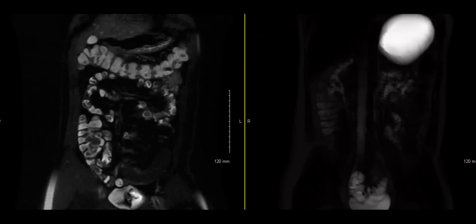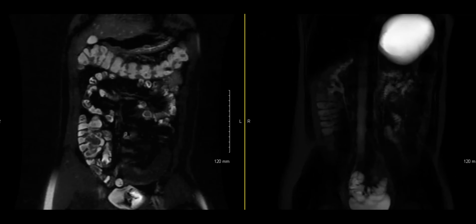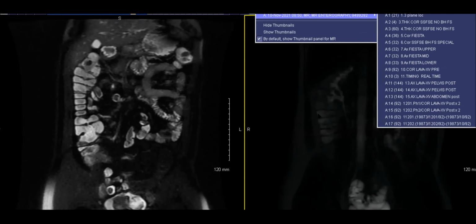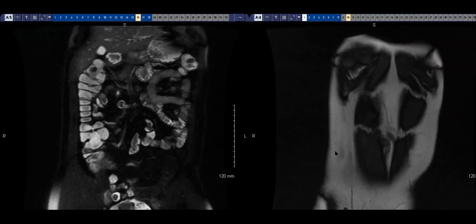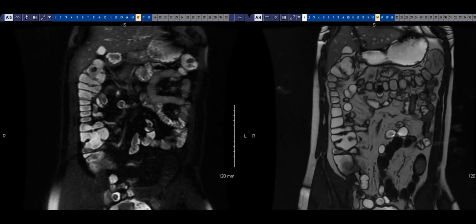Yes. So this is a young patient that came in, history was unclear, no really prior history, some sort of abdominal pain, blood, inflammatory bowel disease. So the fellow calls me and says, well, have you ever seen appendicitis on a random MRE? To be honest, no, I've seen appendicitis on MRI, but not appendicitis incidentally found on MR enterography. So the resident is all proud and says, well, look, clearly there's appendicitis.